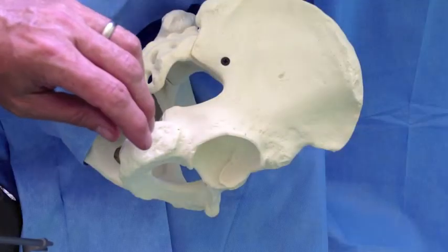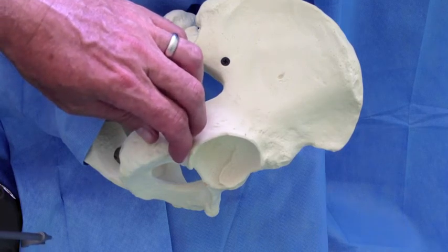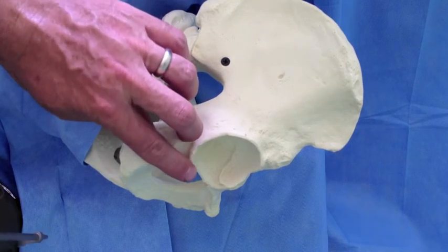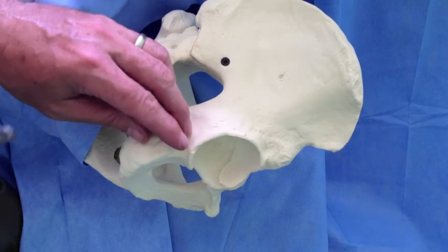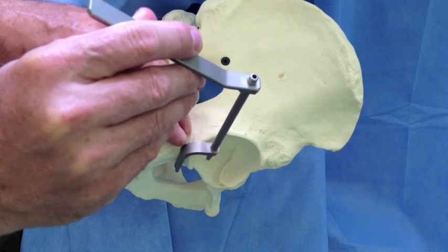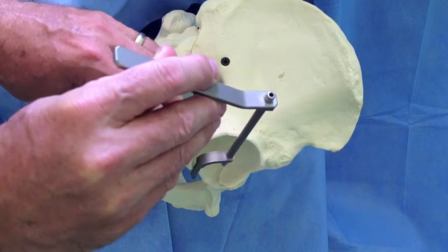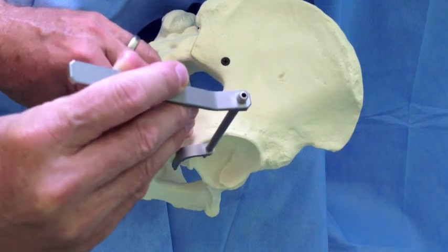You will find that it is easiest to insert this by temporarily replacing your posterior retractor with your non-dominant hand and then feeling the posterior rim of the socket. The finger of the calibrated drill guide is then placed into the infracotyloid notch. Take care not to place it in the region of the transverse acetabular ligament.